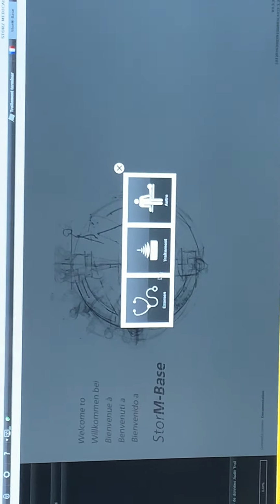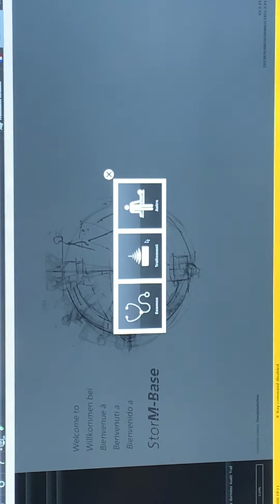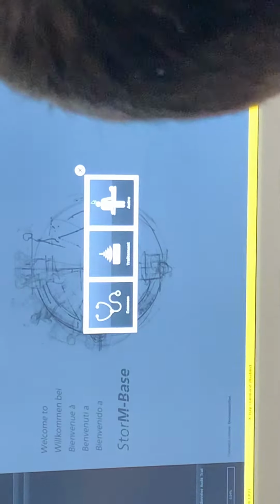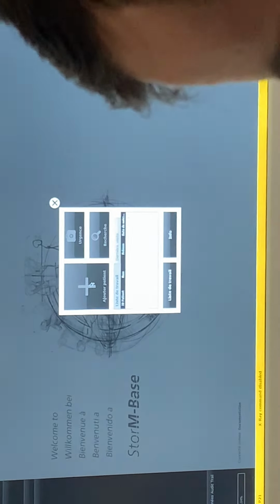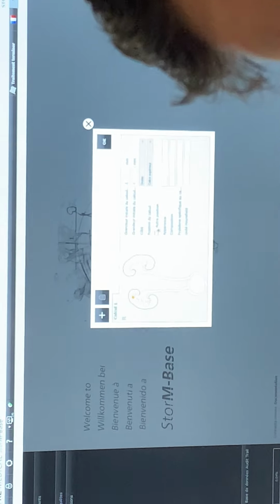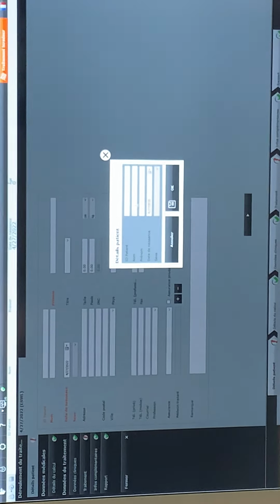You will choose the patient and press book patient. Now, wait, stop. Now he pressed only book. Let's go back, because now you did another workflow. Normally you need to choose your patient. You didn't choose your patient and press book. What is happening then? It is also booking a patient, but offline. Only on our system.